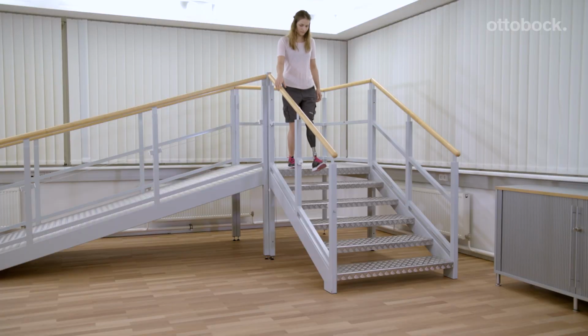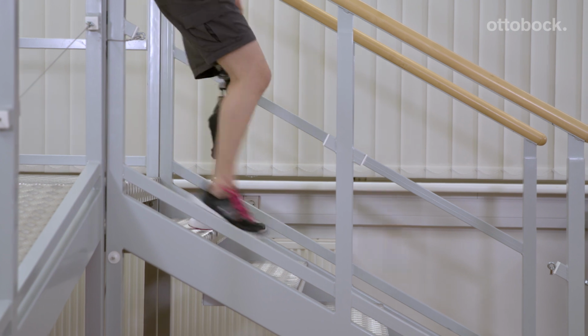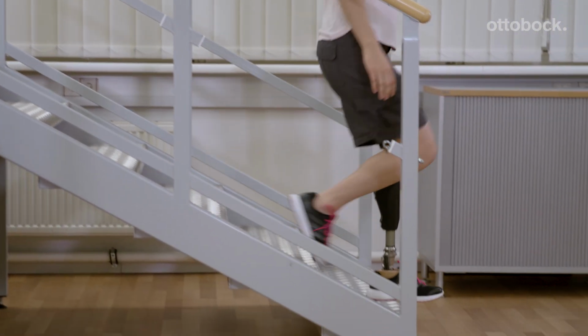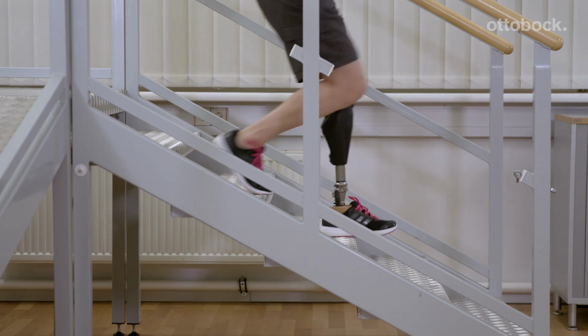In the next step, determine the optimal setting for going downstairs. Search for a value that ensures a consistent alternating step pattern. Pay attention to an upright posture and the correct foot positioning.